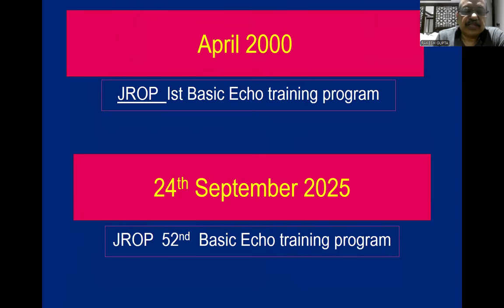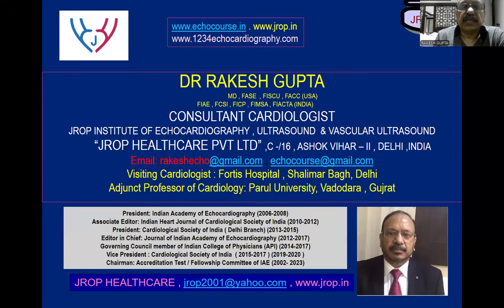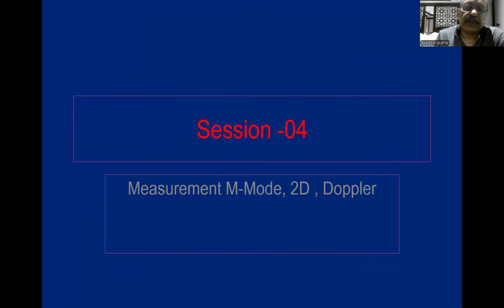Well, we started this program on 24th of September. And now today we are going to deal with the fourth session, talking of M mode, 2D and Doppler measurements. And that's two parts of it. With this, let me switch over my gears.